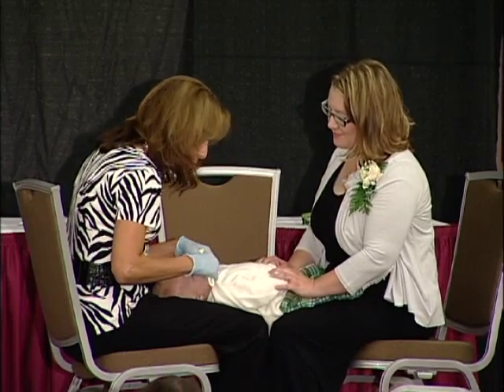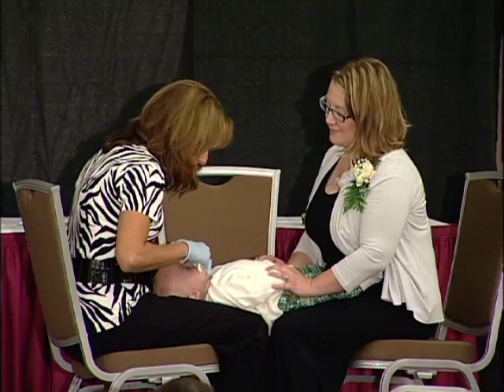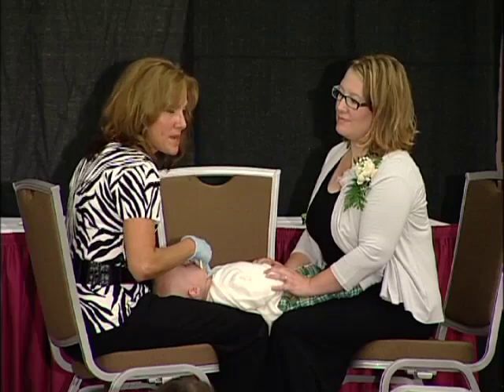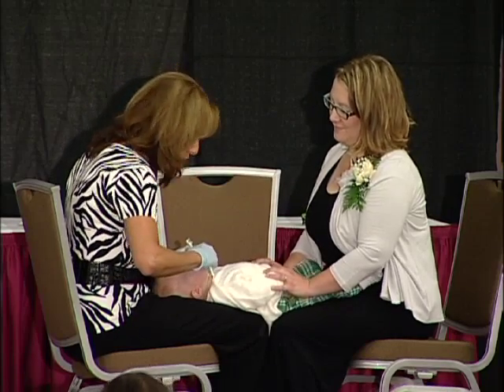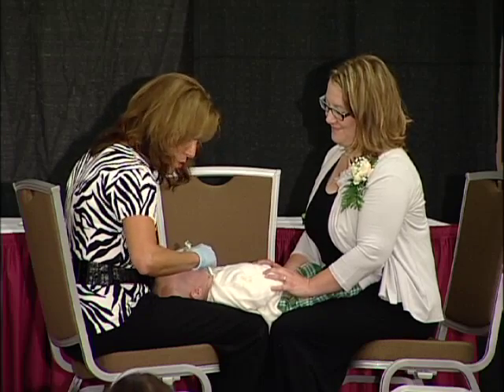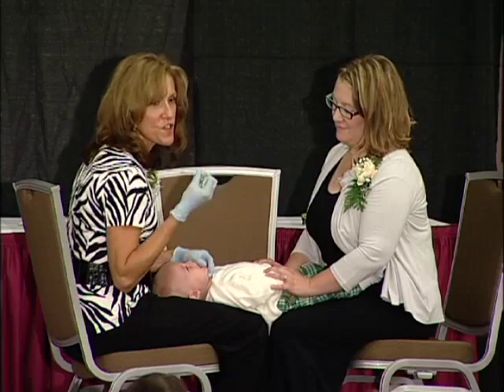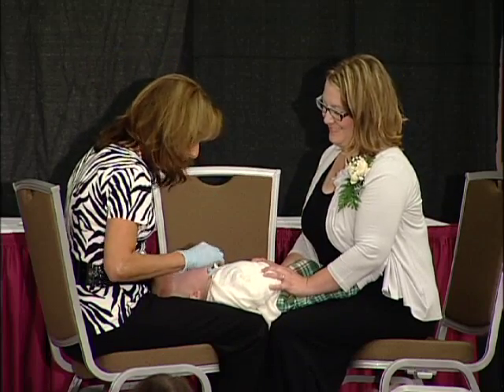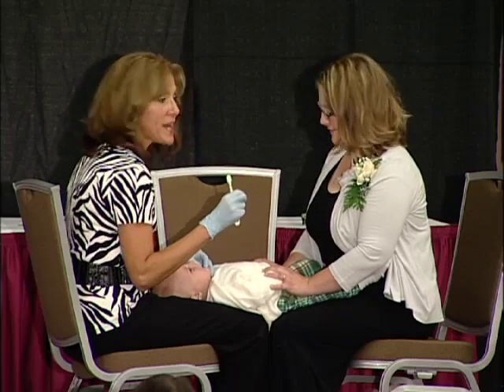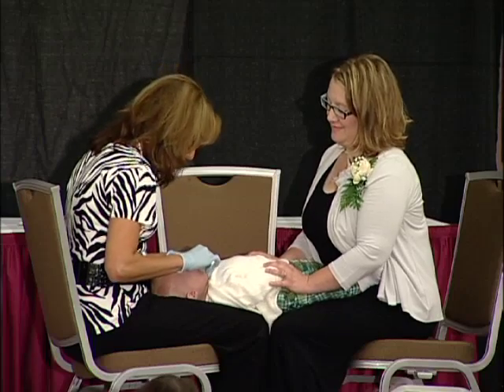Well, all the while we're in here, not only are we looking for plaque, we're going to be looking at eruption sequence. Make sure eruption sequence is good. Health of gum tissue. We're going to look at all the vestibules. We're going to look for eruption cysts. We're looking for cervical demineralization. Don't be afraid to use a little 2x2, maybe your air, just to dry something off.